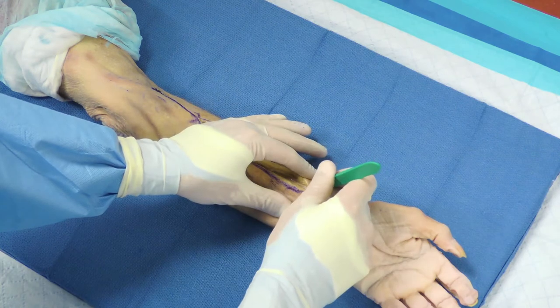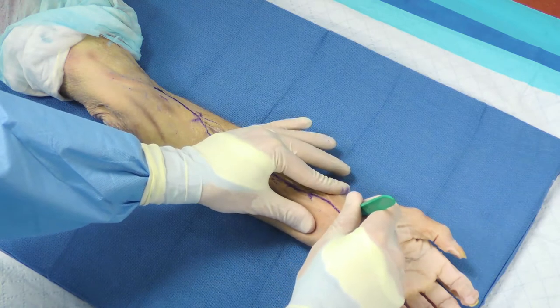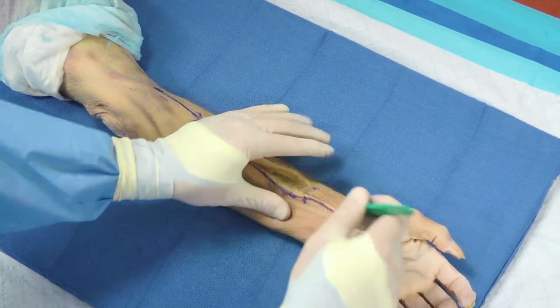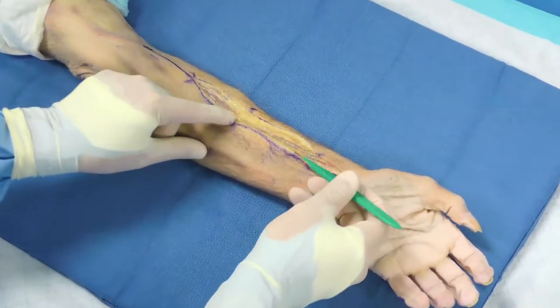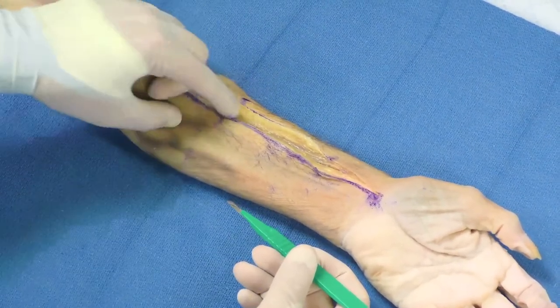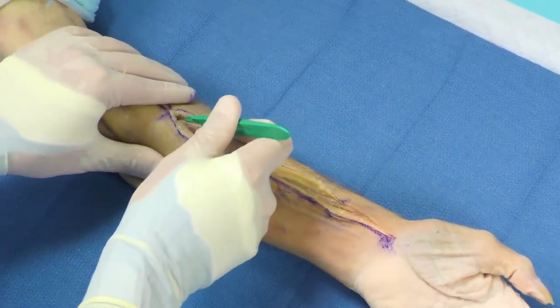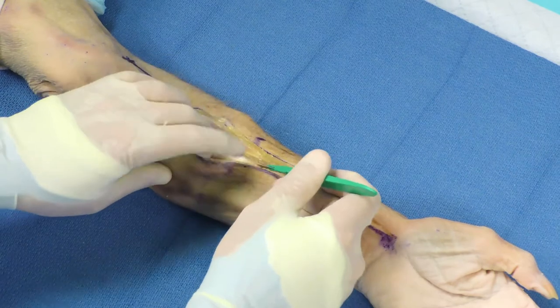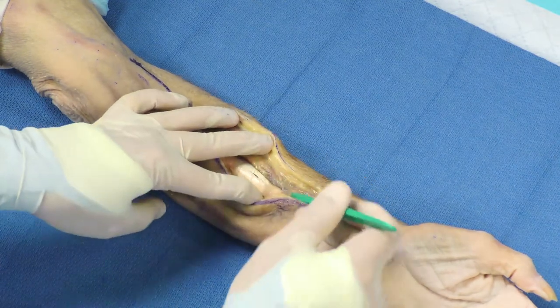To demonstrate the anatomy, I'm going to extend my incision down along the FCR so you can see anatomy familiar from distal radius fixation. Deep to us is the FCR tendon and the radial artery will be on the radial side of that. As we get more proximal, the brachioradialis and flexor carpi radialis muscle bellies will be together — that is our interval to get down to the radial shaft. I'm incising the fascia and epimysium of the muscle. If you're on the FCR tendon, you know you're safe because the radial artery is just radial to you.